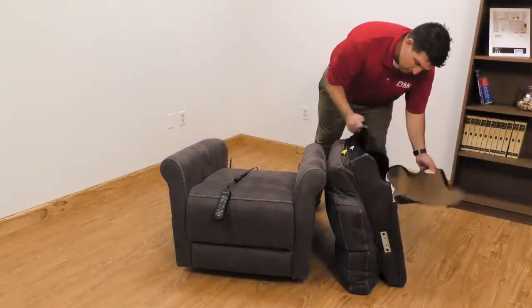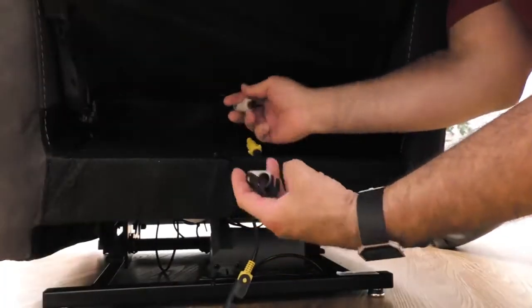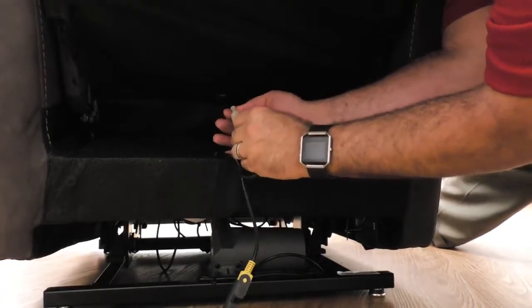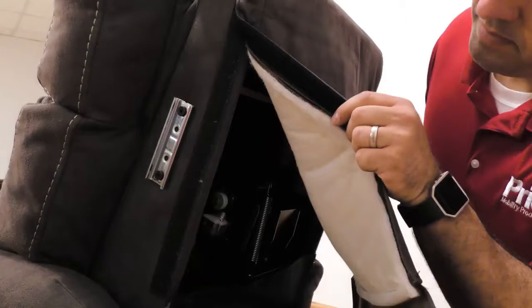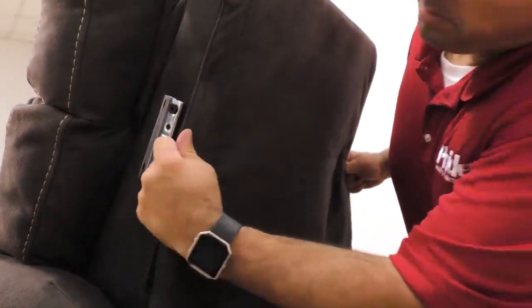Next, attach the backrest by lining up the KD brackets on the right and left recline brackets. Push the back into place until you feel the KD clips lock. Easily identify the color-coordinated motor connections and plug together. The backrest has full access to the motors for ease of serviceability. Align the hook and loop on the back upholstery to secure it.